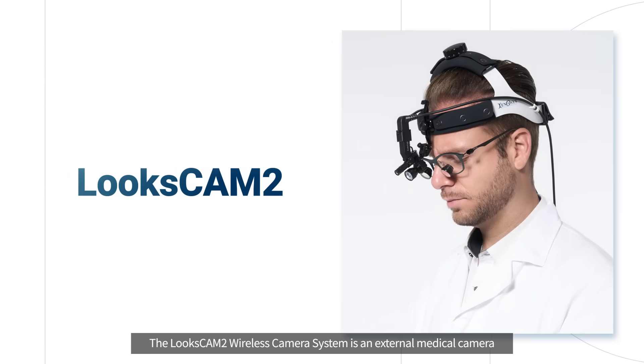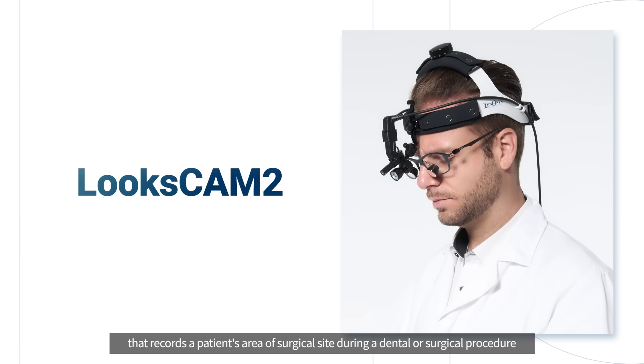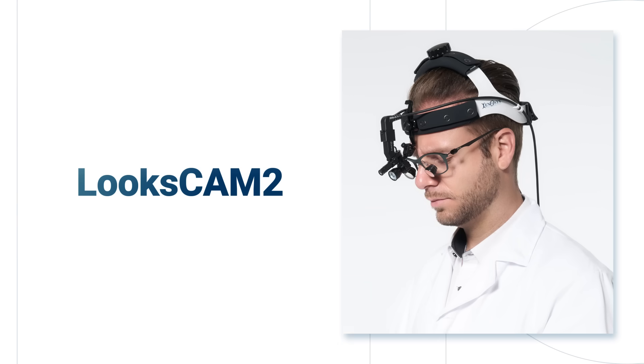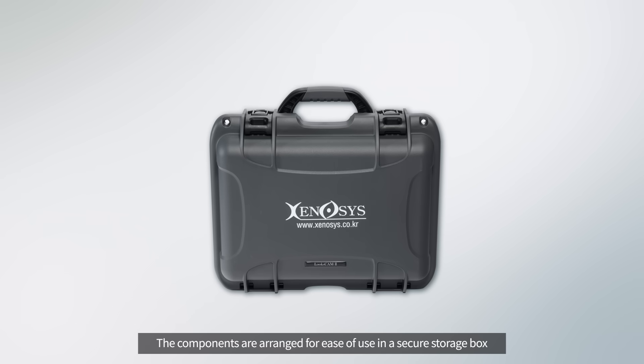The LooksCam II is a wireless camera system and external medical camera that records a patient's area or surgical site during a dental or surgical procedure. The components are arranged for ease of use in a secure storage box that protects the camera from external shocks.